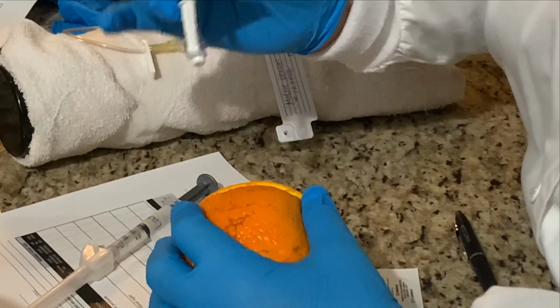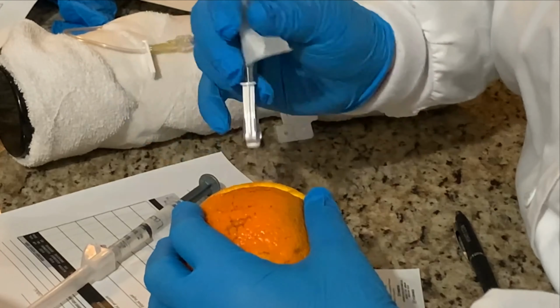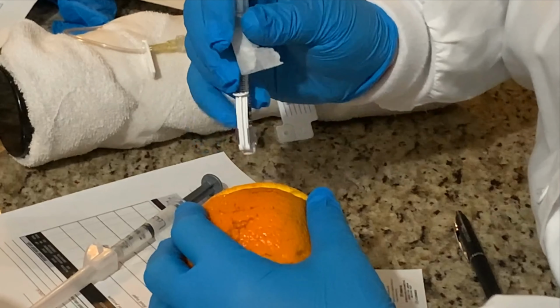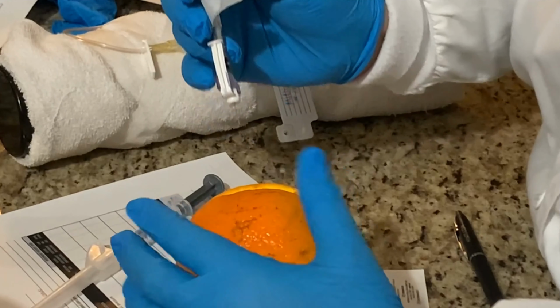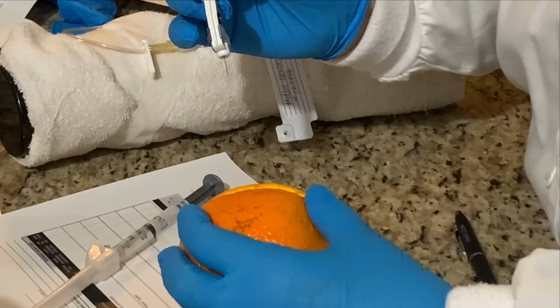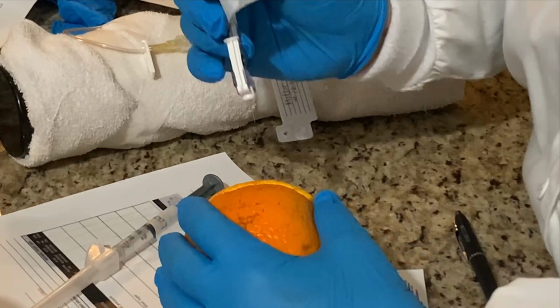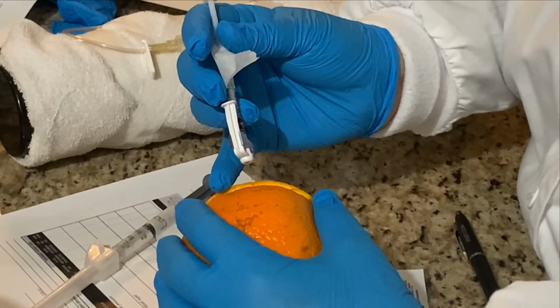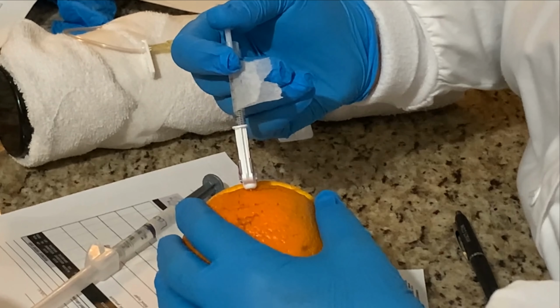1, 2, 3. Now you can do this, I forgot to tell you, at a 90 degree or a 45 degree. A lot of folks don't understand a 45. So I'm going to show you a 45. So because Millie is thin, I want to do a 45. Because there's the dermis, the epidermis, and underneath there's sub-Q or fat tissue. Underneath that is muscle. And because she's thin, that's why we pinch it up. So I'm giving it a 45 degree angle. 1, 2, 3. Inject her insulin in.